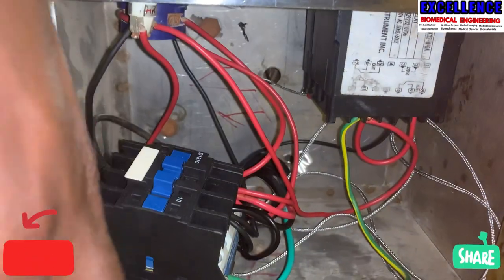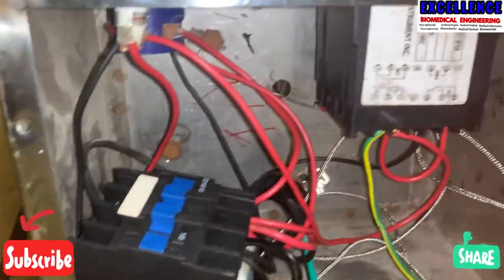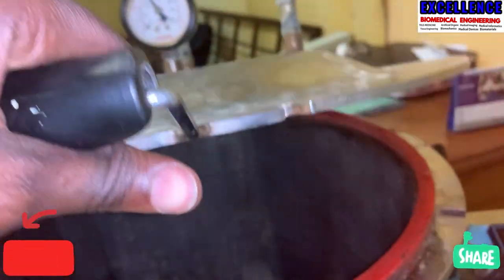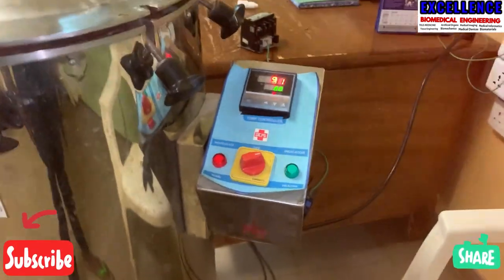Inside the control box, as you can see, this is the electric contactor which activates when it is energized by the controller. It then sends power down to the elements, and the elements heat up — it's very hot, very very hot.